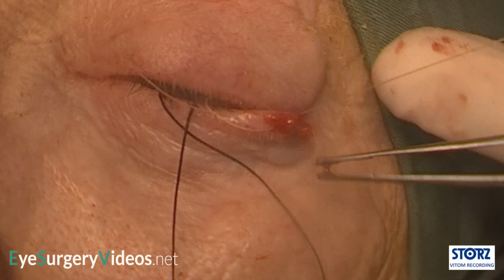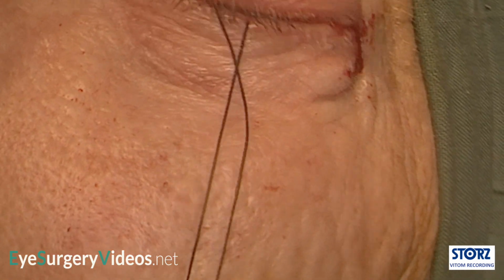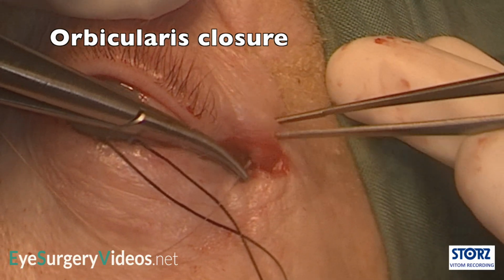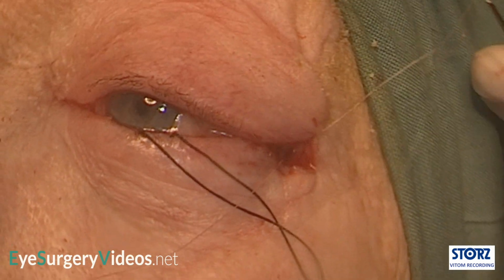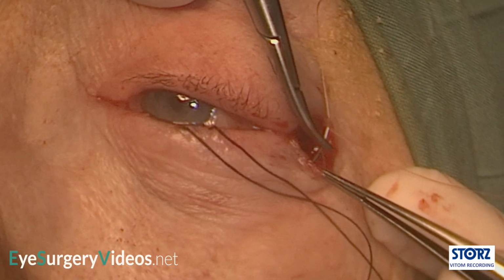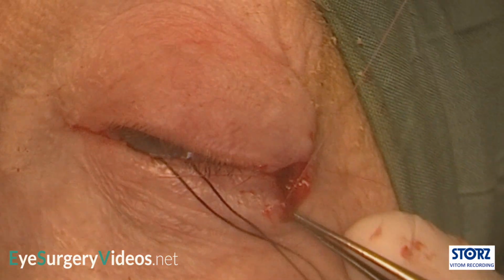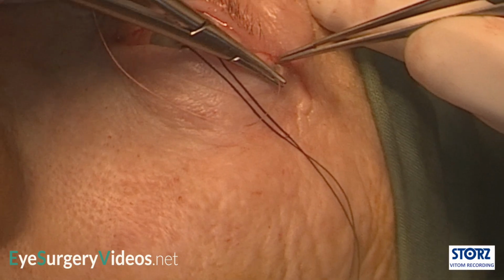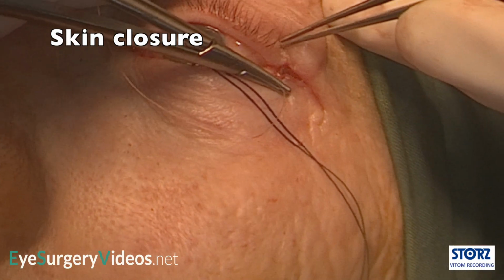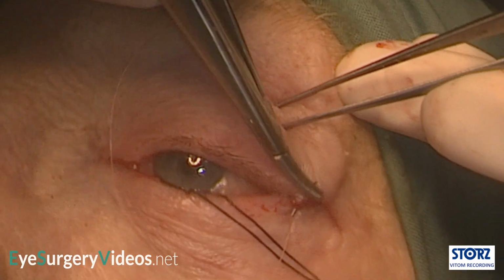The tarsal conjunctiva is repaired with a 7/0 vicryl suture. The retractors are not separately repaired. Overzealous or crude retractor repair probably increases the likelihood of entropion. The lateral canthus is reformed, orbicularis closed, and the skin closed. If eye padding is used, the vision and pupils must be checked 1 to 2 hours post-operatively to ensure a retrobulbar hemorrhage is not developing and causing optic neuropathy.